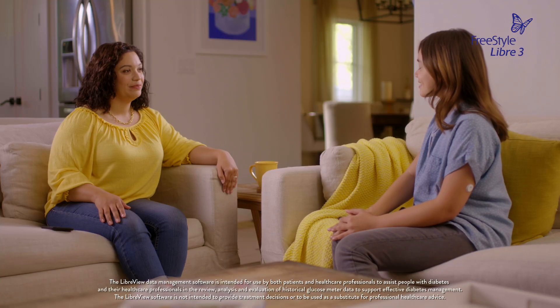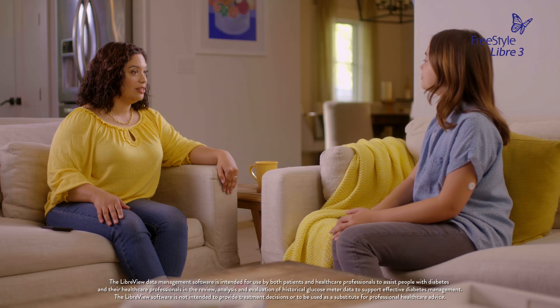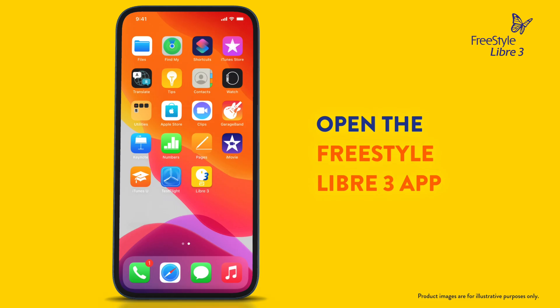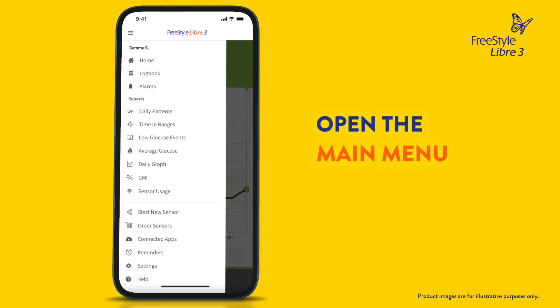To invite someone to see your glucose readings on the LibreLinkUp app, you will need a LibreView account, which you can create right from the app. To get started, open your Freestyle Libre 3 app, then open the main menu.